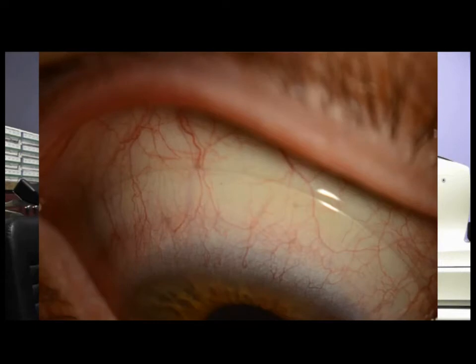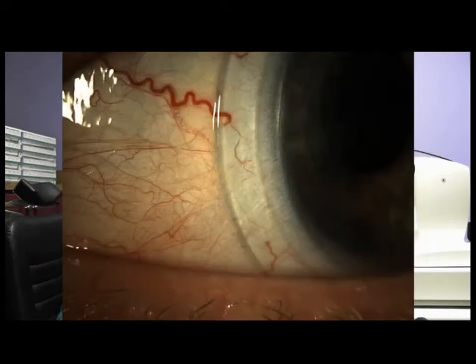Is to make sure that there's no impingement or compression of these conjunctival blood vessels. Now look down for me. And here we have a very good alignment of the haptic. I'm going to flash up on the screen an image of a haptic that is not well aligned and that there's actually compression. You can see that it chokes off the blood vessels as they go through the edge of the lens, and that's a sign that you need to flatten the haptic.